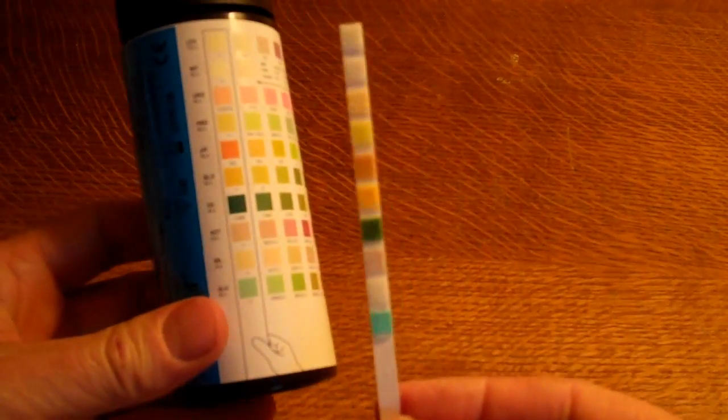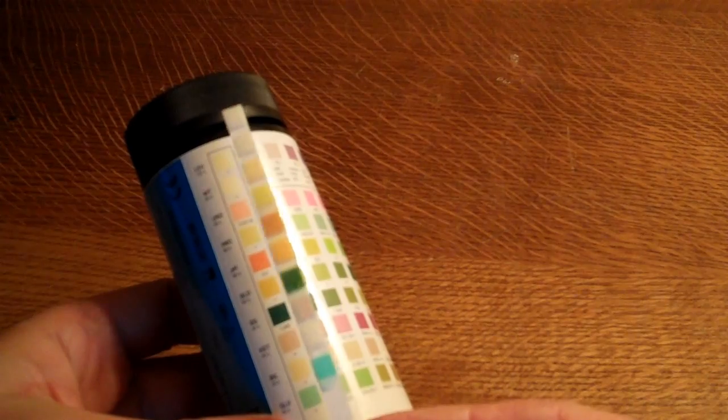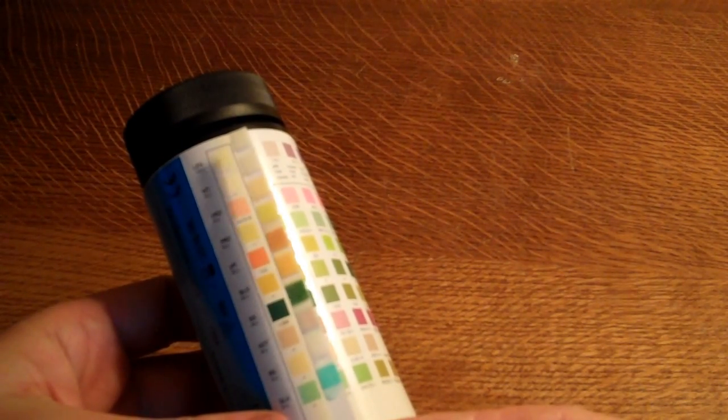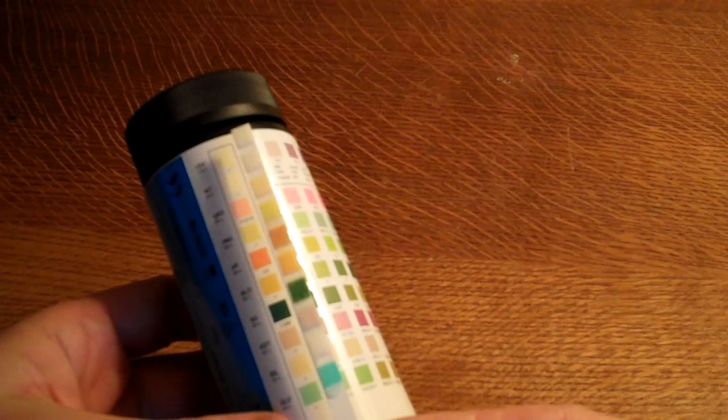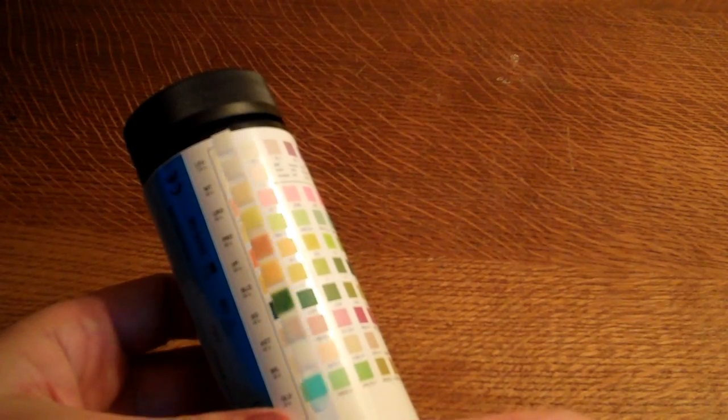Okay, so this dip test has been dipped two minutes ago, and again you're looking at this first column. If it matches all these colors on the pad exactly at two minutes, then you've got an all negative result. It's not detected any of these.